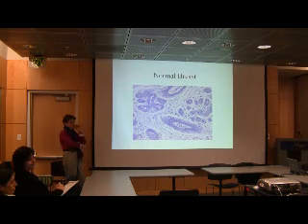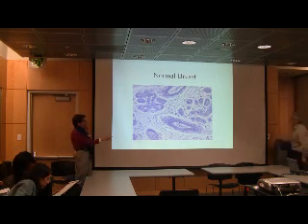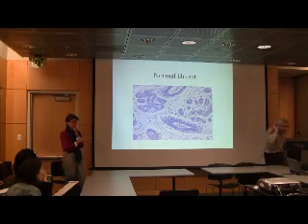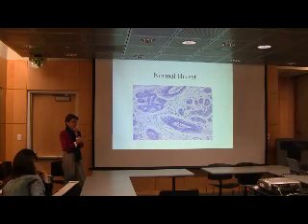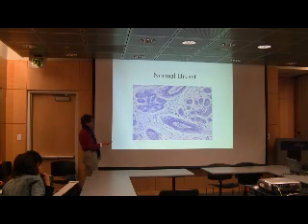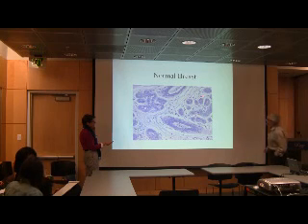How about the pink dots, red? Good question. What do you think they are? What color? Pink or red? Red. Blood? Blood. Yeah, exactly. Those are blood cells. Those are red cells, erythrocytes, red blood cells.